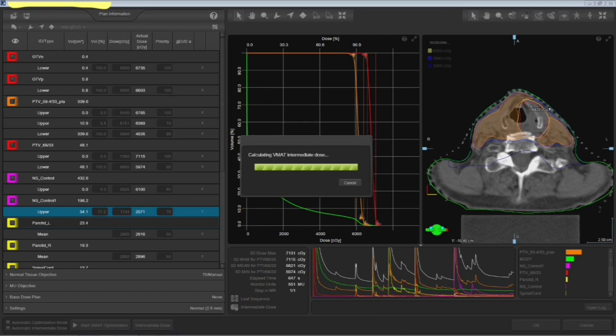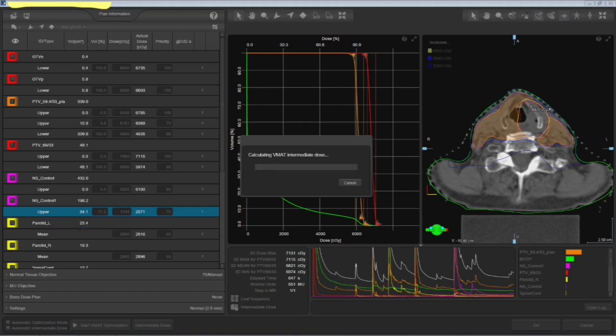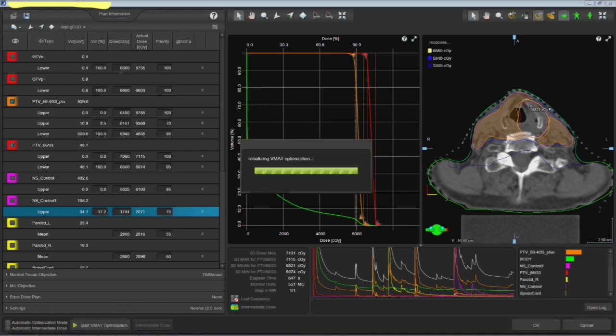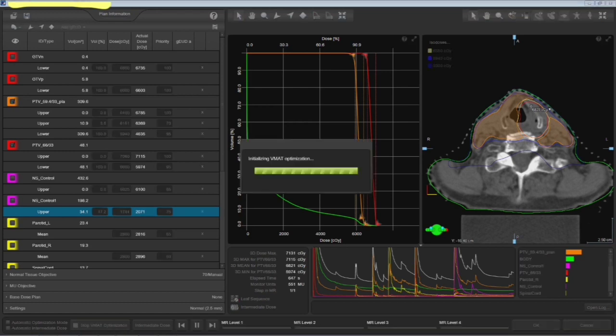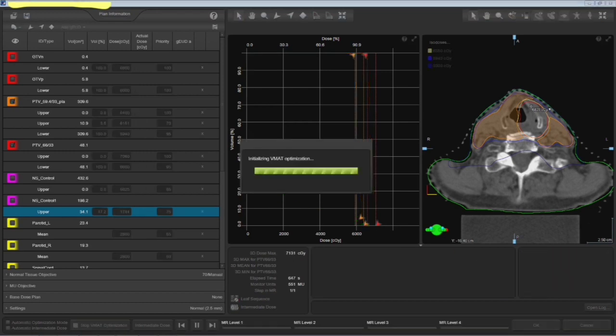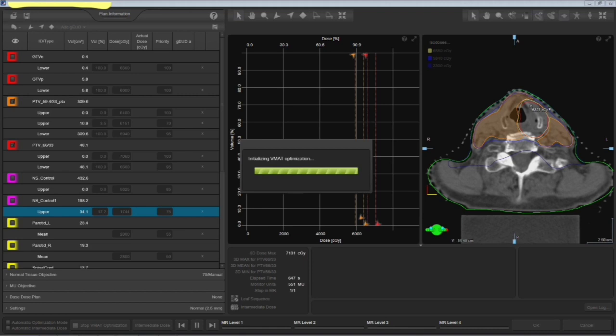Yeah, now the intermediate dose calculation started. We'll definitely talk about that, what is this intermediate dose calculation, why it is required. And then you have to hold it here to look at the true distribution. This is very important.